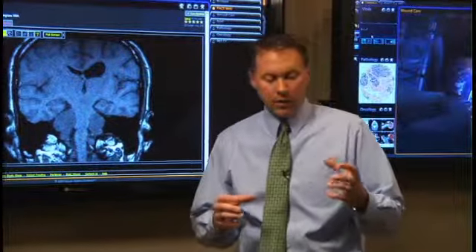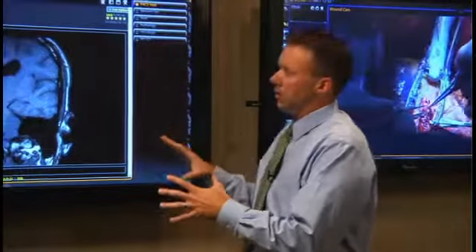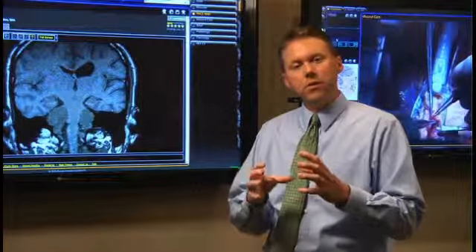In addition, if the doctors get frustrated by all of the different viewers that they have to interact with on those CDs that they're bringing in from all of their referral base, there could be 30 or 50 different places that send them patients, and they could all come with 10 or 15 different CD viewers, and it's frustrating for a physician to have to interact with all of those and find the measurement tools and the window level tools, etc. Within ControlOR, we actually have created an application that will read those all into the same viewer, so that no matter where those discs are from, you get a lot more continuity for the surgeon to know where all of those tools are, and they're much more efficient in that respect.